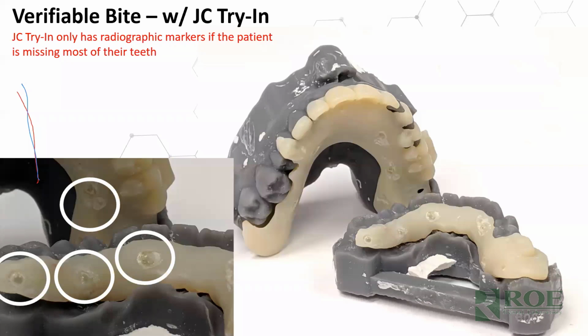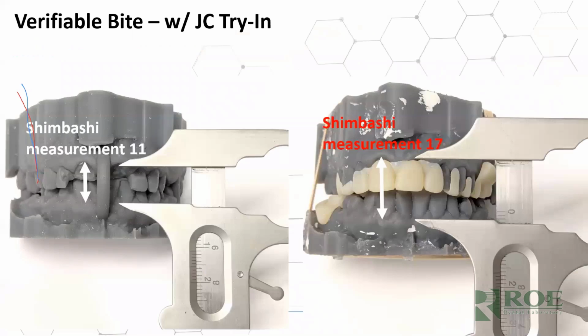Okay. JC try-in may also have some scan appliances. This is case-by-case basis, depending on how many teeth the patient has remaining. If the patient just has a few teeth, couple teeth, 1 tooth, and we're still making a JC try-in, because sometimes if the patient has almost no teeth, we probably want to go a different avenue, bite blocks and setups. But if we've made a JC try-in in the situation, we will probably put markers on it, and then you would do a dual scan when the patient is in. Right? The dual scan technique, just like the denture dual scan, which we'll discuss at the end with edentulous cases.